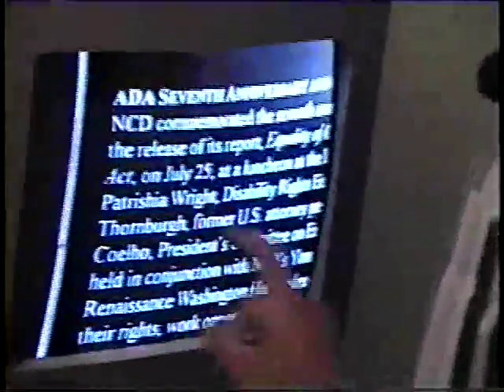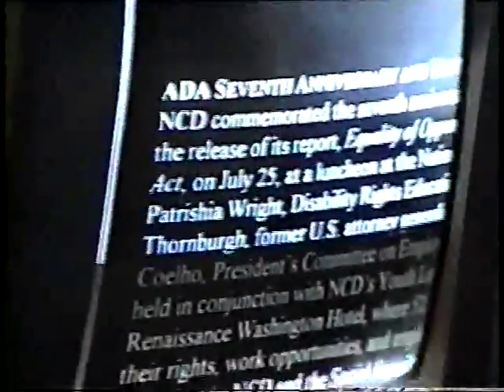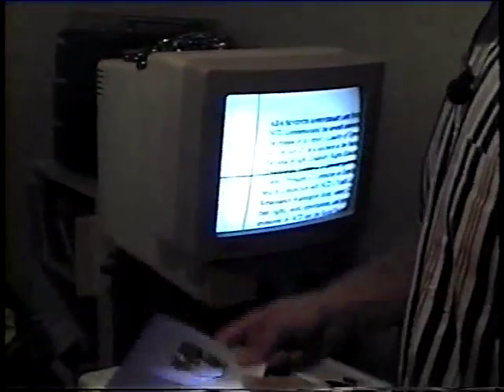You can either have it black on white or white on black, and you can zoom in and zoom out. You can also take a picture. This is a picture of a group of us that went to King's Dominion. Standard photograph. Put it back on the standard setting, and it's not in color, it is in black and white, but you can take the picture and zoom in on the people. So this is the way I read things that are in print.